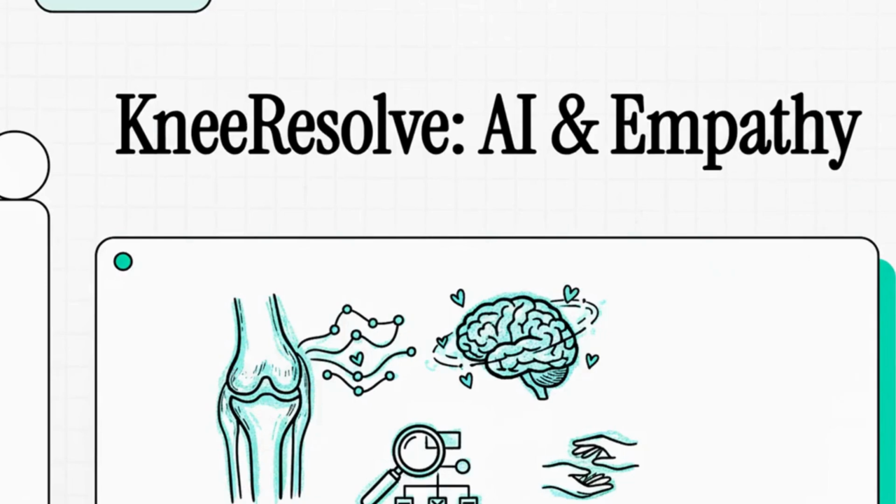Thank you. Okay, so what if you could actually teach artificial intelligence to be empathetic? It sounds like science fiction, right? Well, today we're diving into a new prototype called KneeResolve, and it's a tool that's trying to do exactly that, blending cutting-edge AI with genuine human compassion to solve a huge healthcare problem in a totally new way.